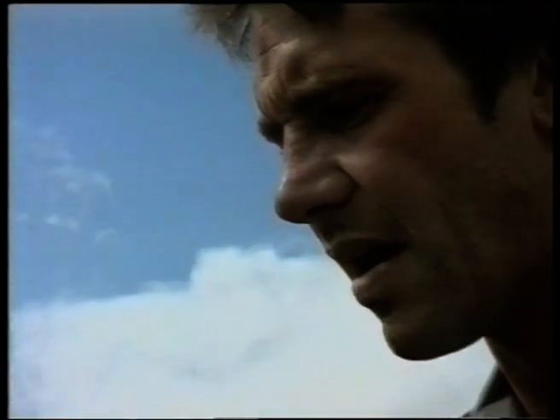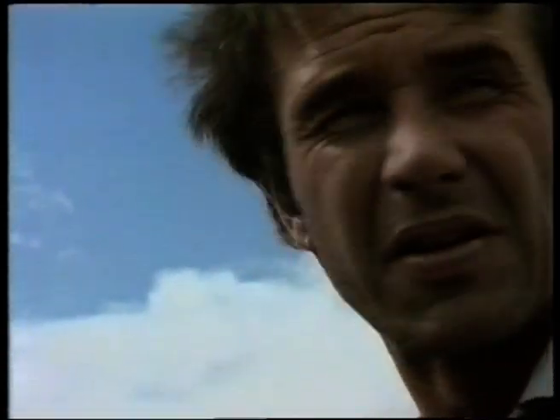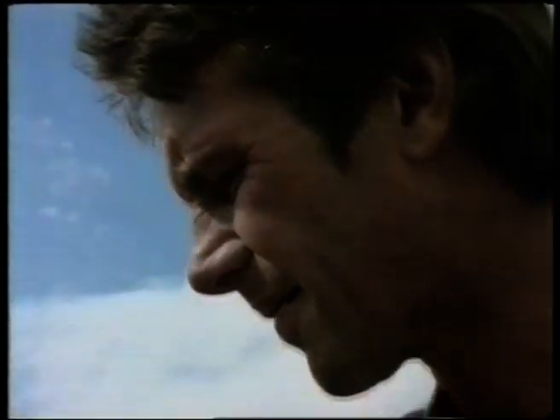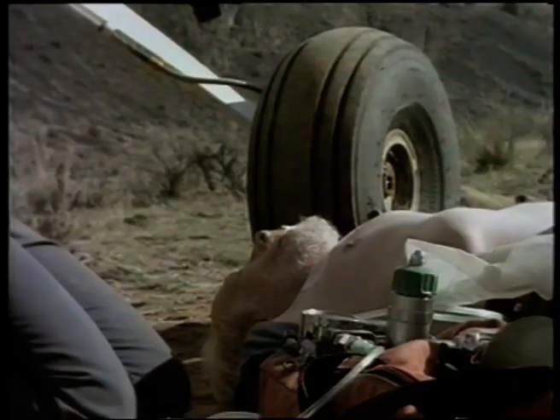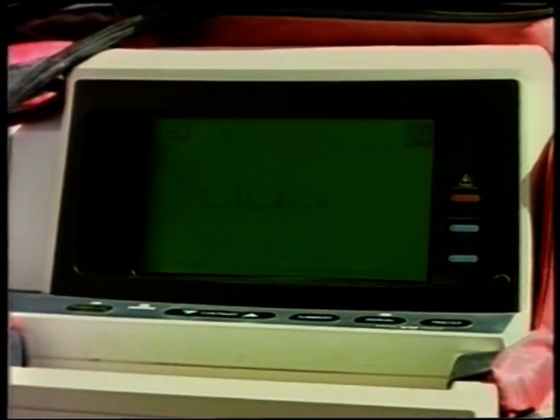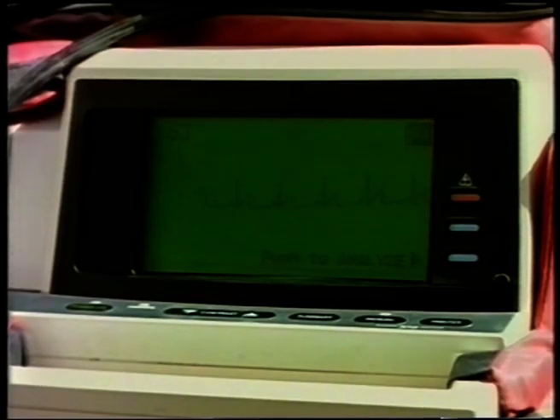Our EMT loudly announces, I'm clear. I'm clear, you're clear, everybody clear? He is verifying that everyone, including himself, is clear of the patient. Then he pushes the push to shock button to deliver the shock. With energy transfer, the message energy delivered and the number of shocks delivered appear on the display.